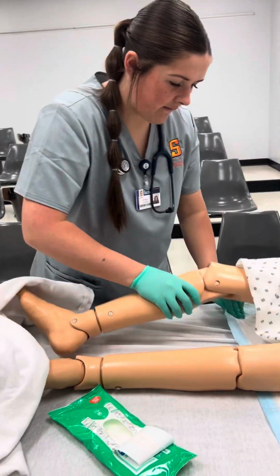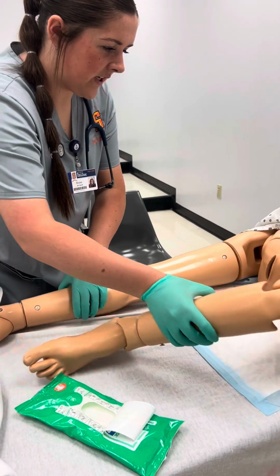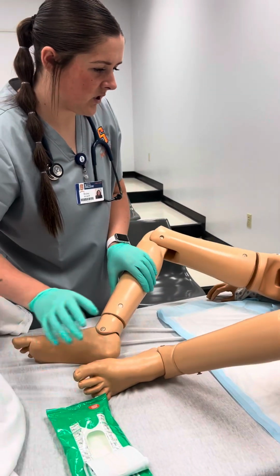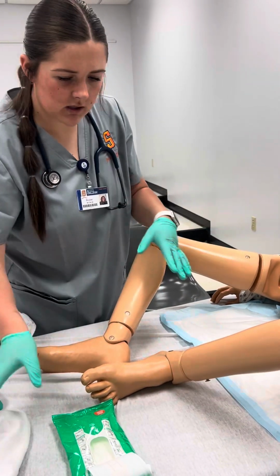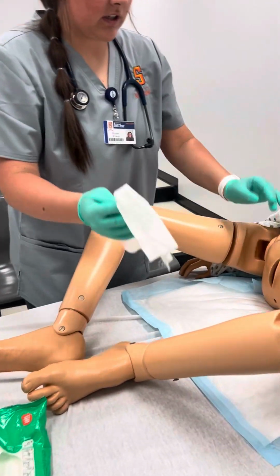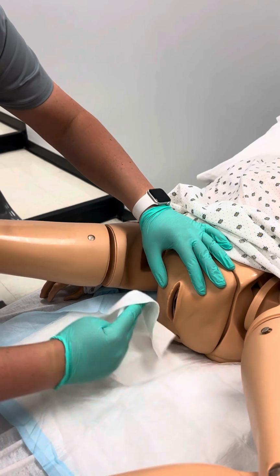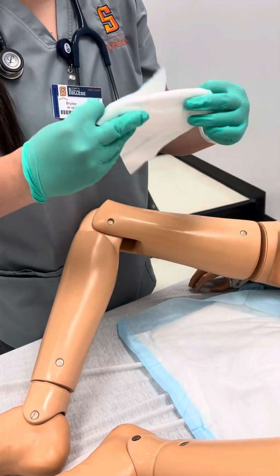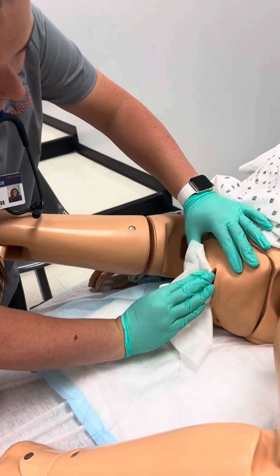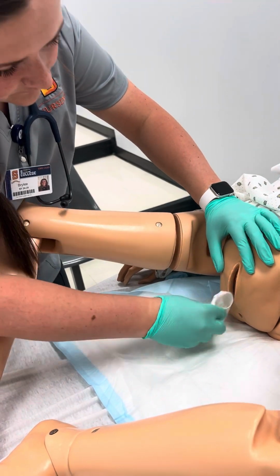And it looks like we have a Chux underneath you, which is great. Okay, I'm just gonna place you in dorsal recumbent position, which is like this frog-like. This way I can just clean the area, okay? Okay. And I'm just gonna start by cleaning the labia one side, top to bottom, getting a new side of the wipe each time, top to bottom, and then right down the middle.